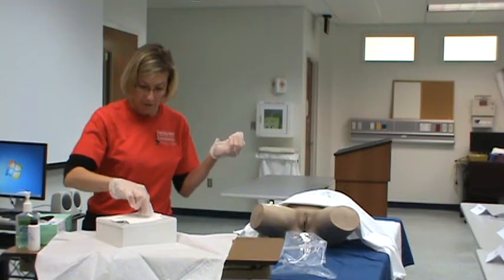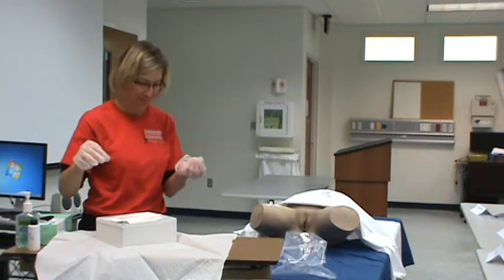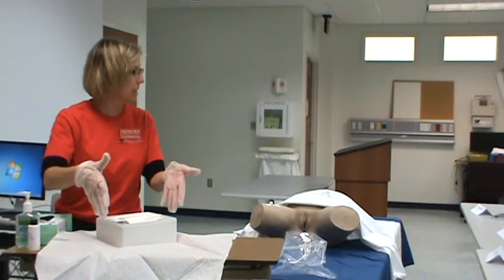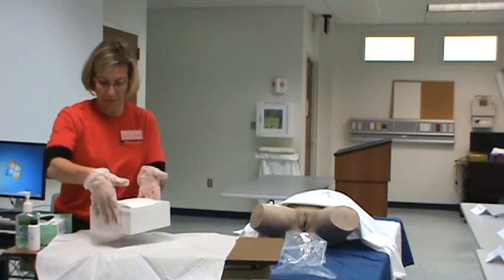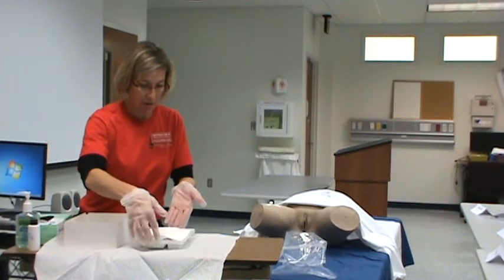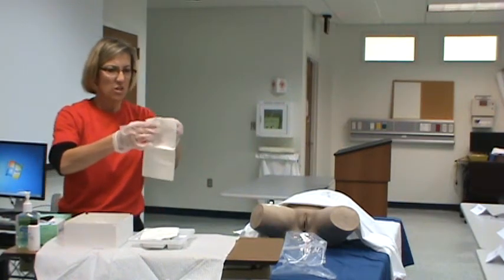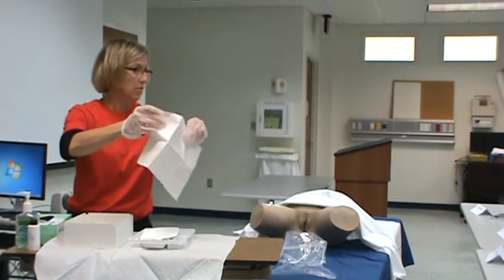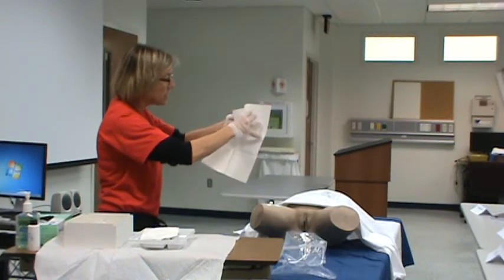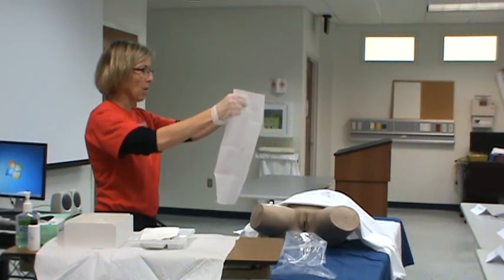The next thing appears to be, it's kind of like Christmas every time you go in these bags or boxes, because you might have the underbutt drape first. Well, for me it was the gloves. So now I'm sterile. Now I can rearrange things the way I want them to be, keeping in mind my 1-inch margin, and I move this on over here. So this is my underbutt drape, it appears. Remember you're sterile to sterile, so you can open this without being too particular, but you will see one side is shiny and one side isn't. The shiny side goes down, and that's what I have facing you right now, okay?